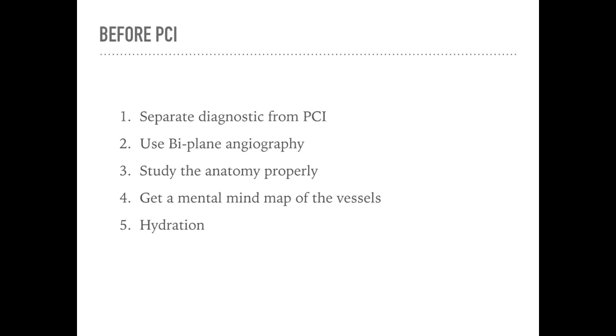Separating the diagnostic study from the PCI gives a chance for the kidneys to recover after the volume of contrast, gives you a chance to study the anatomy properly and have a mental mind map of the vessels so that you don't need to give puffs of test contrast while you're navigating through the coronaries. And of course, it gives you a chance to hydrate the patient before PCI. Hydration seems to be one of the most effective tools that we have in our hands to minimize the nephrotoxic effects of contrast.